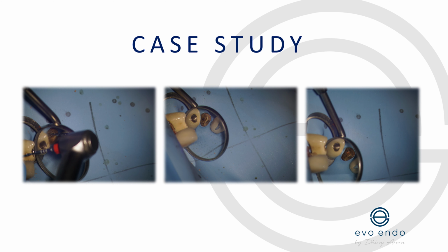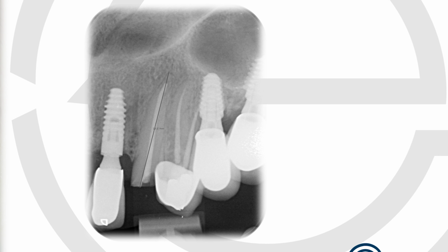So when I'm looking at this sort of case, the first thing we talked about was endodontic status. So let's go through that. In this case, you can see that there is a root filling already in there. So we're looking at, was this patient symptomatic? There's no clinical signs and symptoms at all. Second, radiographic appearance. Looking at the x-ray, it looks like a pretty good endo. It's not too far away. There's no large apical pathosis there, but evidence of potential apical pathosis. But more importantly, the GP is also exposed in the mouth. If there's GP exposure, think biologically first. If GP is exposed, there's bacteria in the canal system. Build a house on solid foundation. So for me, that's a retreatment.